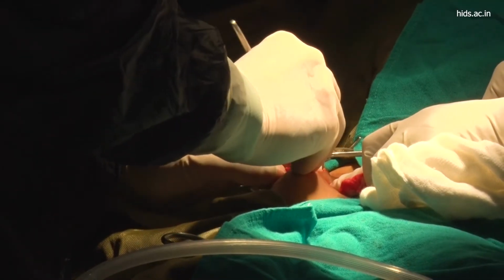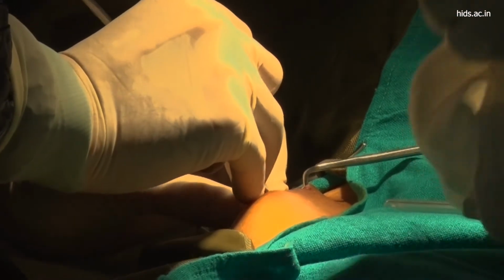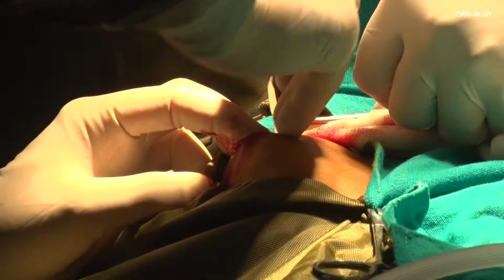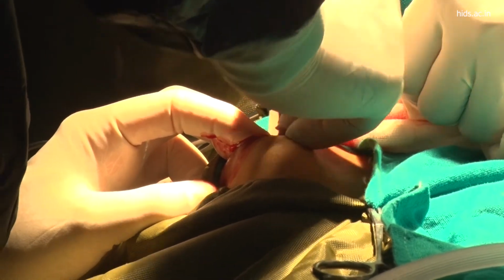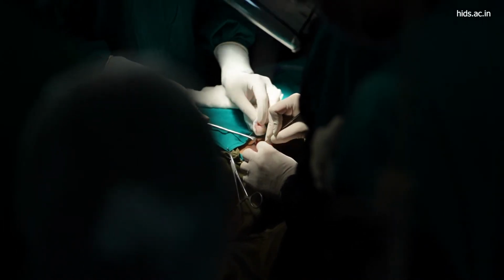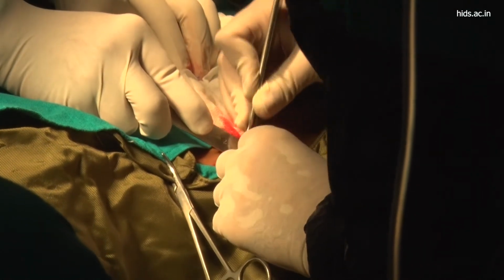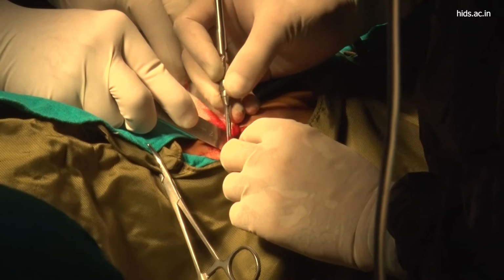This is how we have placed the incision. We have placed the incision in such a manner that after the closure, the suture line should come towards the lateral side. It should not fall directly on the alveolar crest. As you see, we have done reflection very carefully so as to protect the tissues both from the medial and the lateral side.